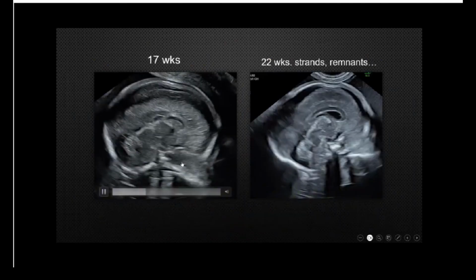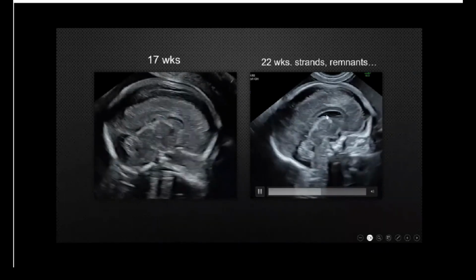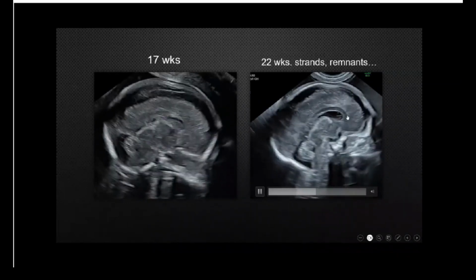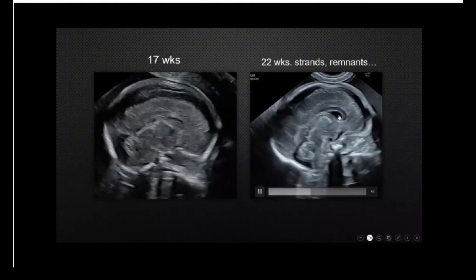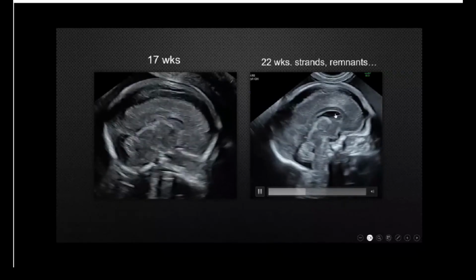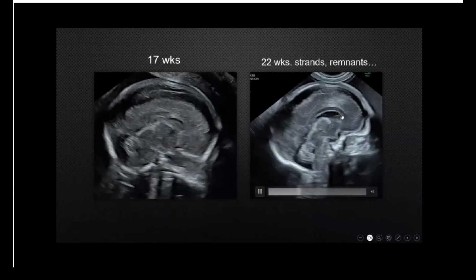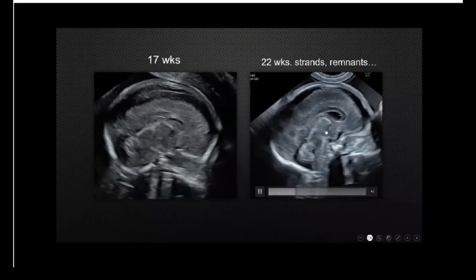Now, again, let me show you the transvaginal ultrasound clip. You recognize corpus callosum, tela choroidea, Monro, and the cellular field, massa commissuralis. And when you look at the fetuses at 22 weeks, sometimes you see strands or remnants, and you see this structure here. Now you can clearly see that there is a cavum septi pellucidi, and inside these small strands are just remnants of vessels that were running here. I told you before, this is a vascular area. There are septal vessels here, and sometimes the cells disappear, but you may have remnants of atretic vessels. There's no flow in these vessels, but the strings are there, and sometimes you may come up with leftovers of cellular tissue, and these are what you may call an obliteration of the cavum septi, but it's not an obliteration. These are cells that just failed to disappear or to be abolished.